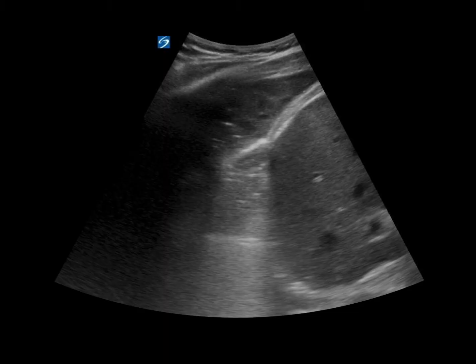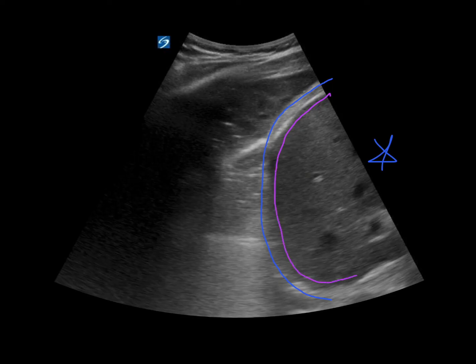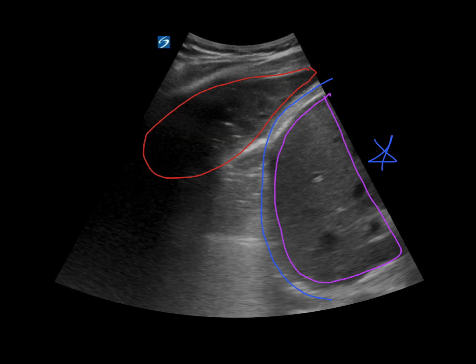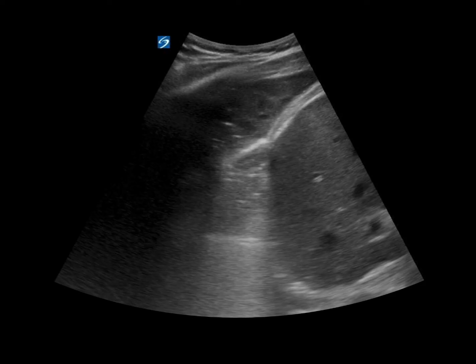When we get close to the diaphragm, make sure to identify it — in this image we can see it right here, and on the inferior portion we see the liver. There is an area that looks isoechoic, or the same as the liver, and we want to be careful it's not mirror artifact — in this case it is not. That is called hepatization: it looks like the liver; the lung is essentially becoming a solid organ, meaning it has fluid in it with no more air. Hepatization equals consolidation — whatever causes consolidation on chest x-ray gives the same representation here.